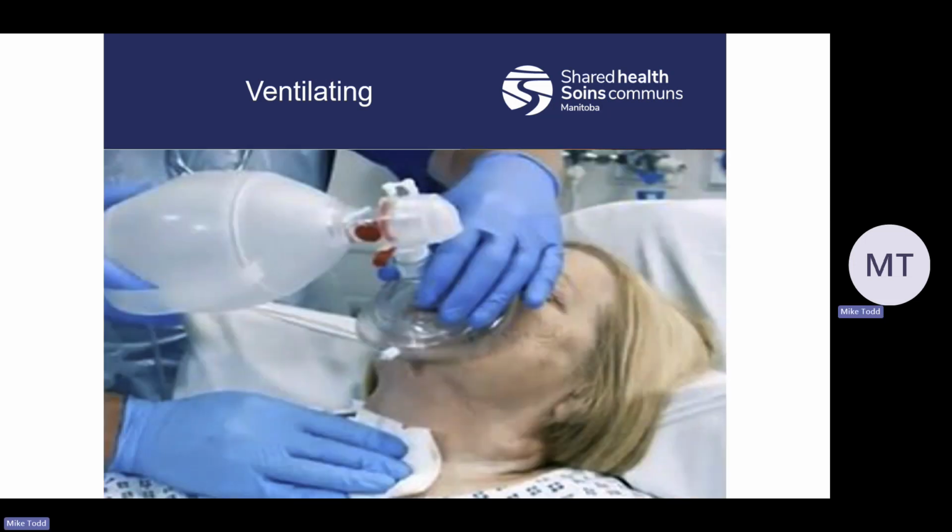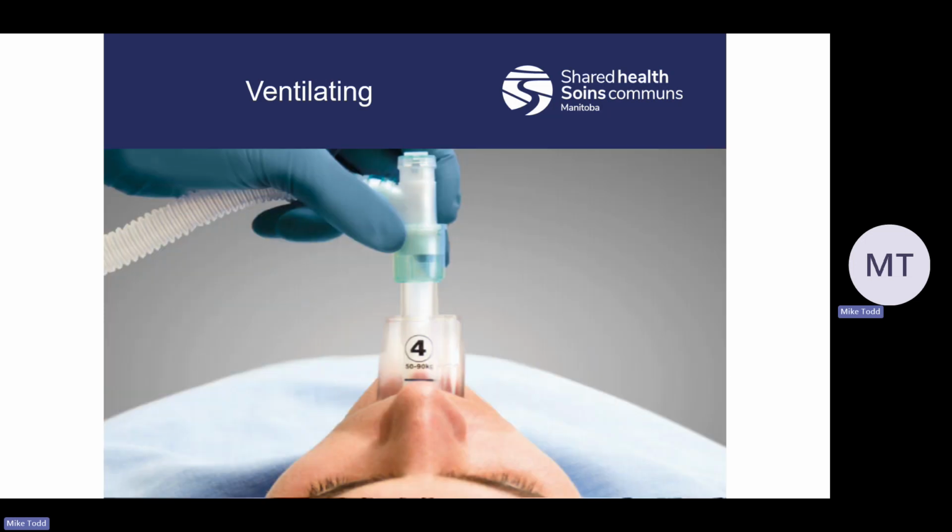The other thing you might have to look at is that if there is an issue and we need to ventilate from the upper airway, we may have to occlude the airway. So if they have a tracheostomy, we may have to cover that site to assist ventilation. That way we're going to ventilate through the mouth and nose, because they still have that open airway higher up. And that would be the same if we're still using an iGel. So we want to cover up that stoma to help prevent air coming out of it. We just want to go right through the mouth and the nose.